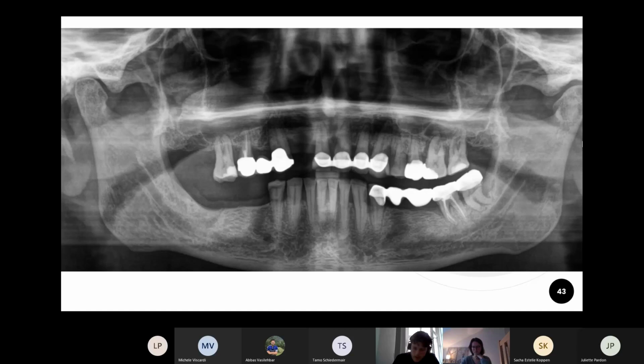All right, so in this one, you can see a huge amount of bone resorption. So you can probably also say that the patient has quite bad oral hygiene. You can see both horizontal and vertical bone resorption. You can see that 1.6 is barely in the alveolar process anymore. And on 3.6, you can see really nicely, mesially, the vertical bone resorption, how it goes straight down. Yeah, so this you definitely have to mention if you get a picture like this in the exam.